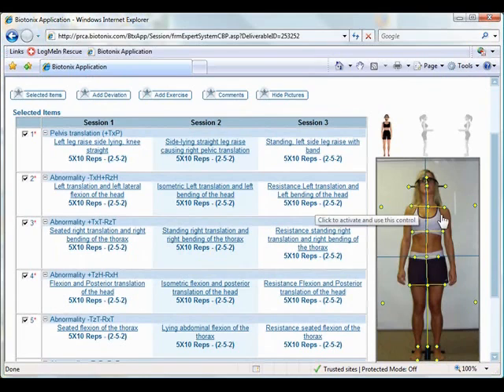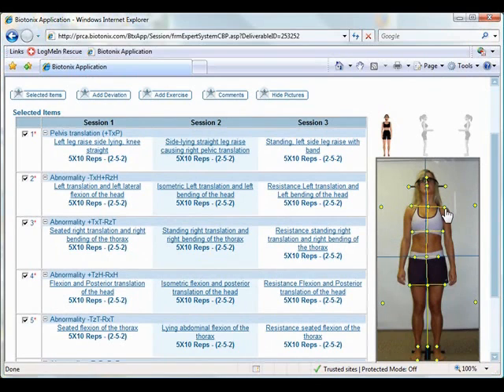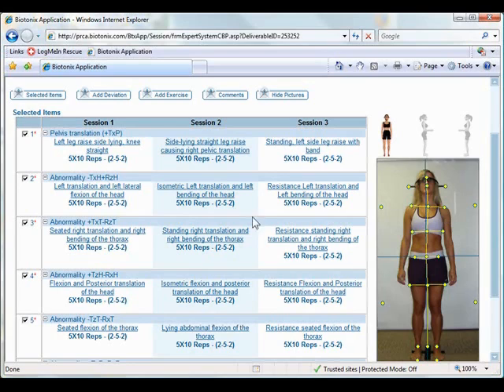So, for instance, you can see that she has, for her thorax, her right shoulder is high. That's a negative RZ of the thorax, and it's also translated off to the side. So, you can automatically see that PosturePrint has found the mirror image corrective exercise here.